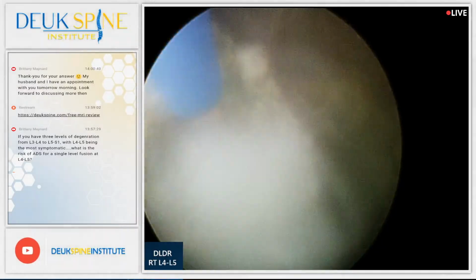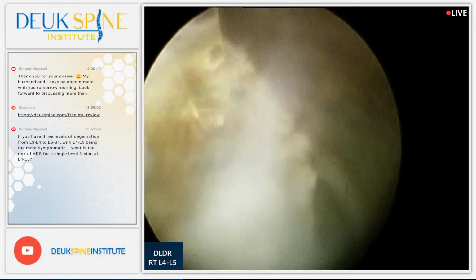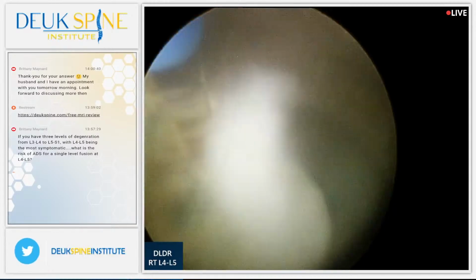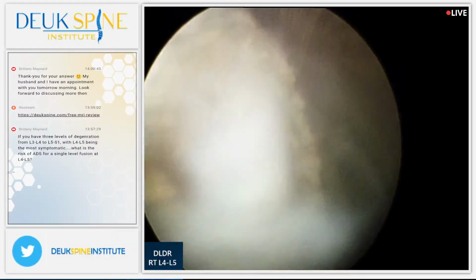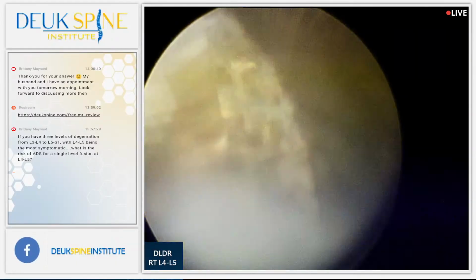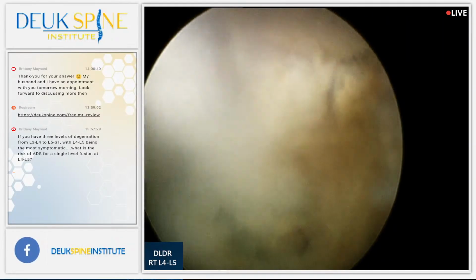All right, so far everything's going well. What am I seeing here? Well, the laser, for your reference, by the way, is about 1 millimeter wide. That's the glass fiber you're seeing, a fiber optic fiber.